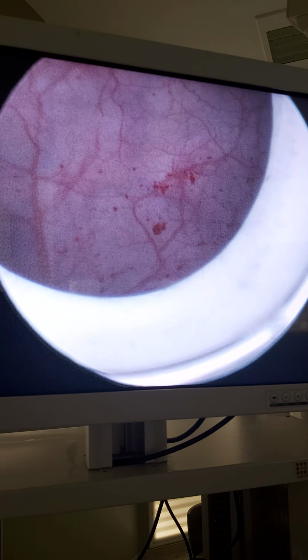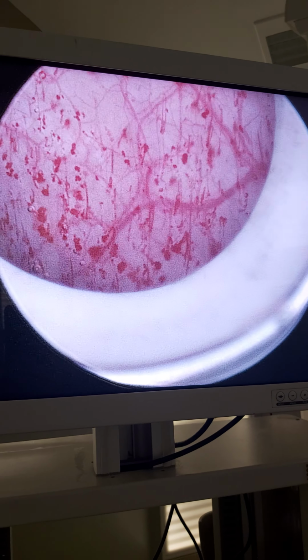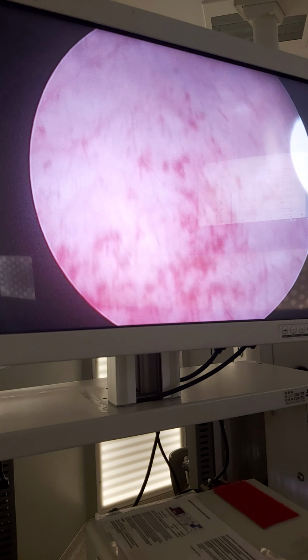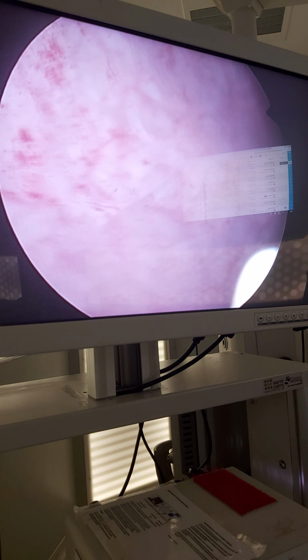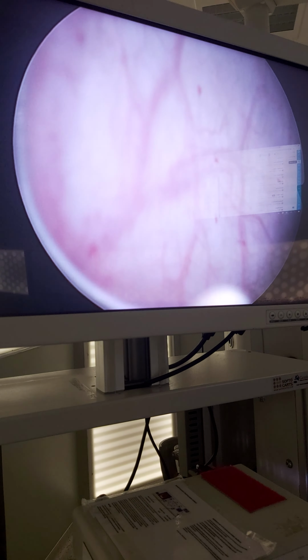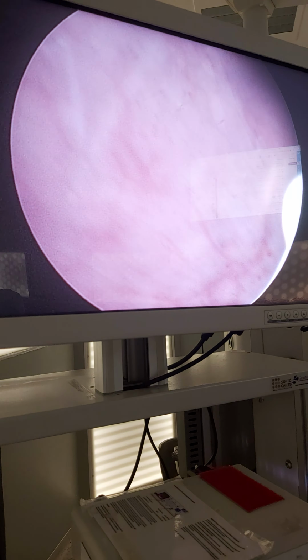I am now emptying the bladder, and we see the spots of bleedings in the fragile bladder wall. And this part, you see, it's not extreme, but it is significant. So look at this part. Bladder wall is bleeding. Okay, we emptied the bladder and see that there are really significant bleedings, and that means the bladder wall is a little fragile. But I don't want to say it's extreme. I have still hopes that we can help. I know there are still some membranes in this bladder.